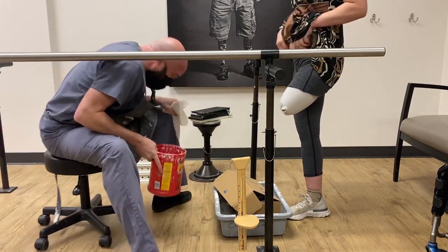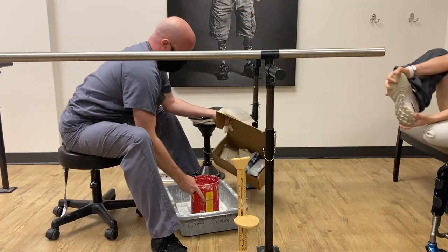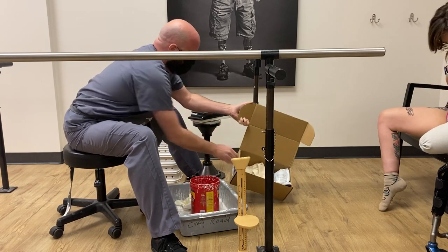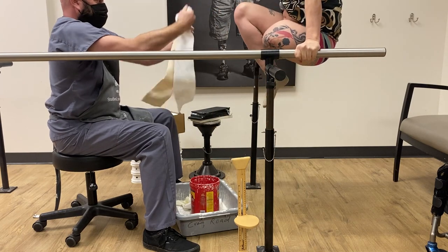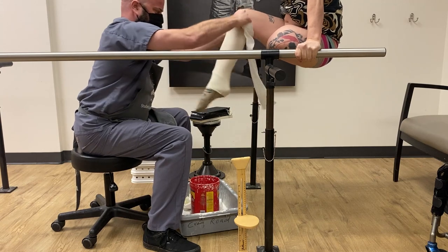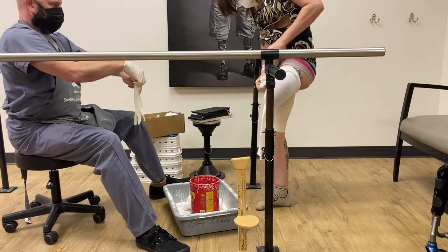I had a revision of my above-the-knee amputation, and so because my limb is shaped a little bit differently, I have to be casted again to make a different check socket than the one I had previously. Just like before, this is a very intimate process, and so it requires trust between you and your prosthetist.